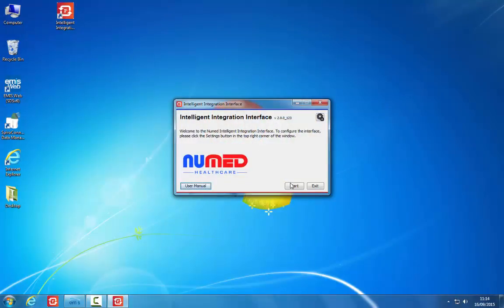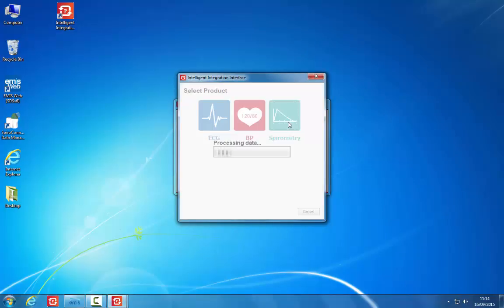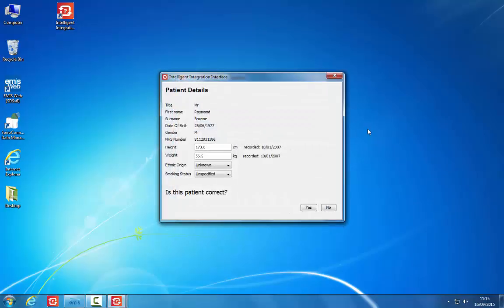Clicking the Start button will take you to the product selection screen. Click the spirometry icon. i3 will now connect to the clinical system and pull through the active patient's details.